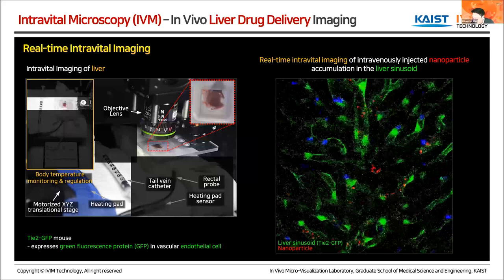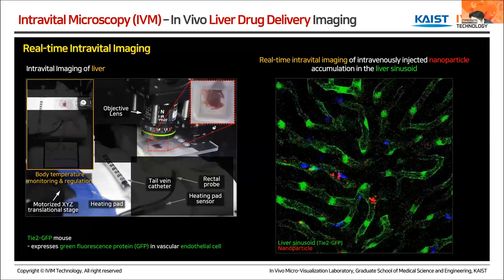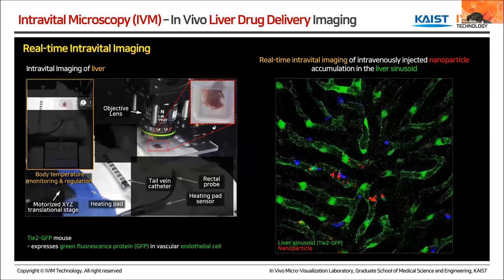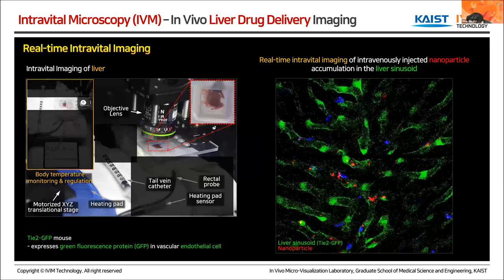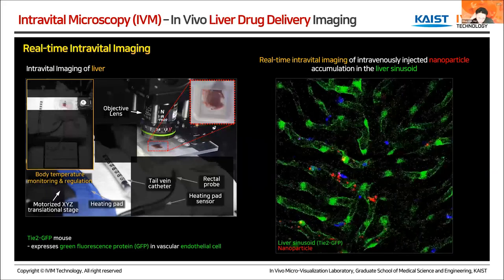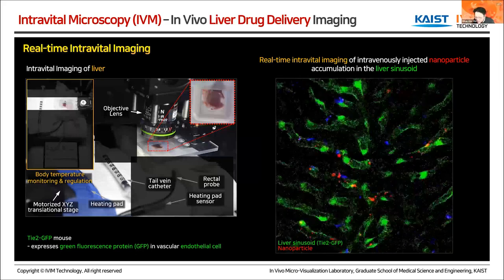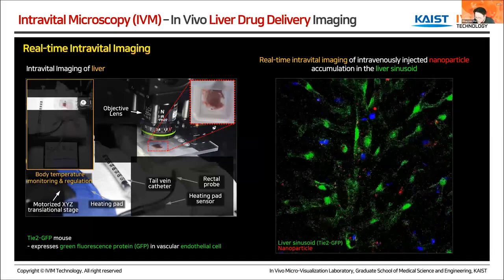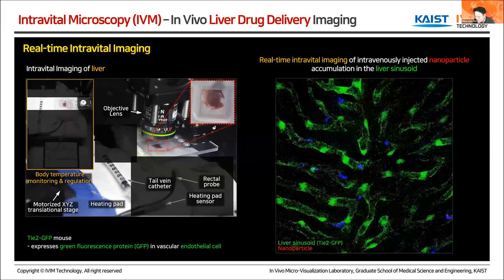system to our microscope. And can an injury be introduced in real time while imaging in order to see the platelet aggregation after stenosis in a mouse model? Yes, we can. We have another option for laser injury.